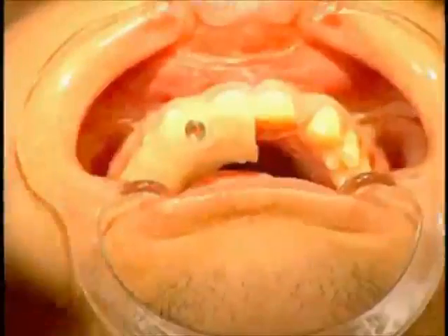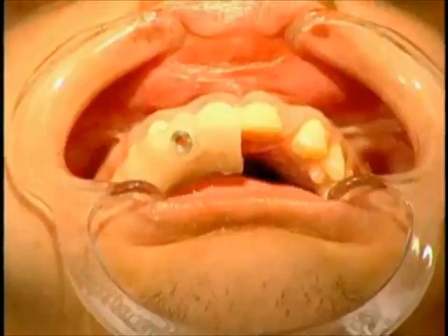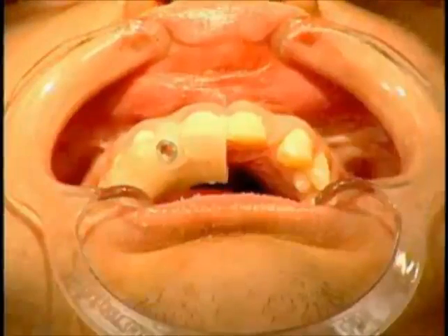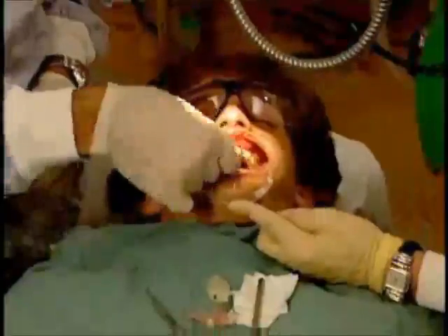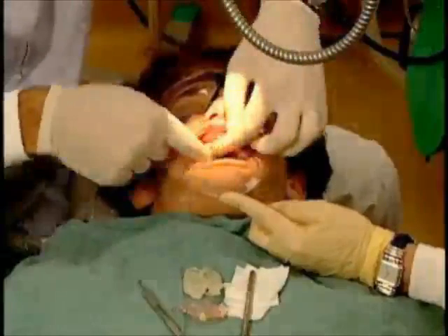What we have right now is a very, very accurate placement tool for us then to guide our surgical delivery of our drills according to the size and shape and diameter of the future implant. So if we take a look at one of the larger ones, and we'll go ahead and go to a larger piece, we go up from a 2 millimeter drill.